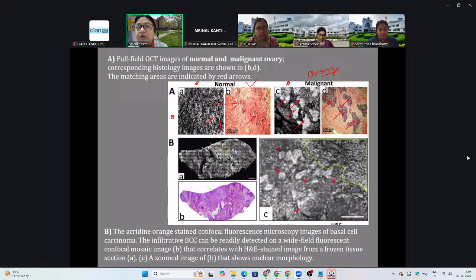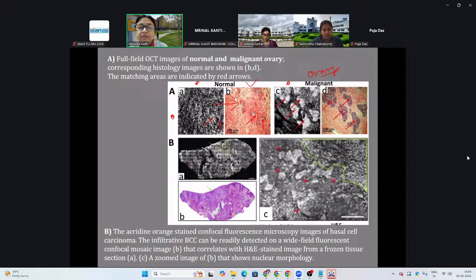If, in this tumor, there was a lot of etc., then I don't know how they would do that sectioning that I just showed you, in that cassette. Everything that we talked about in the stroma yesterday should all be there. Can you identify the macrophage? That's another story.